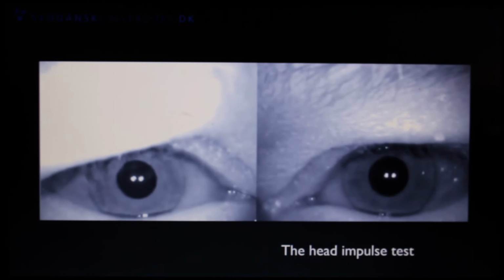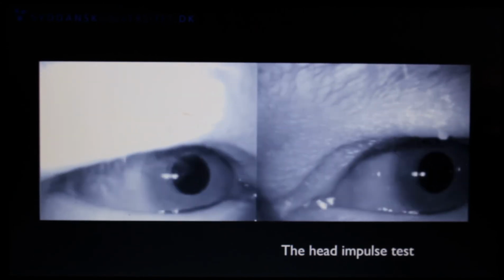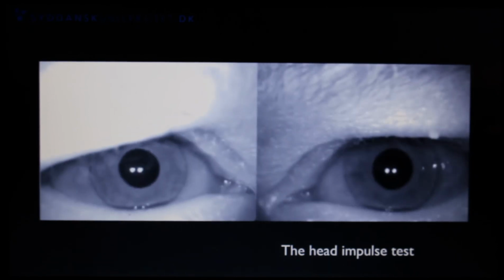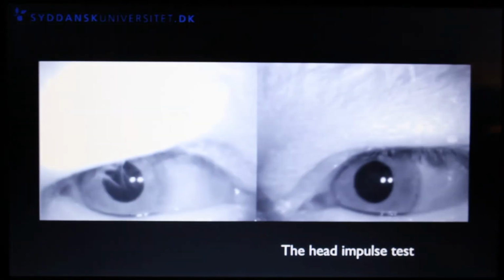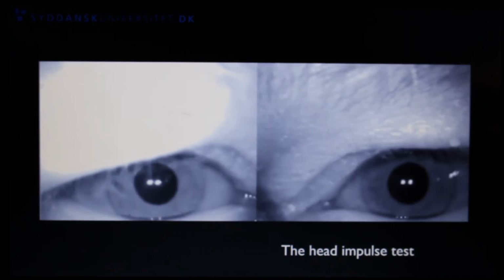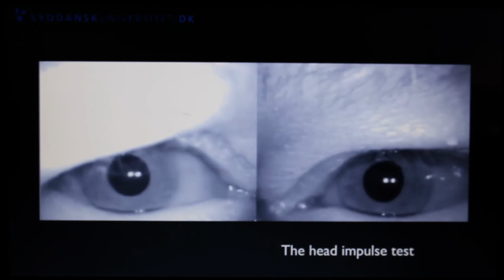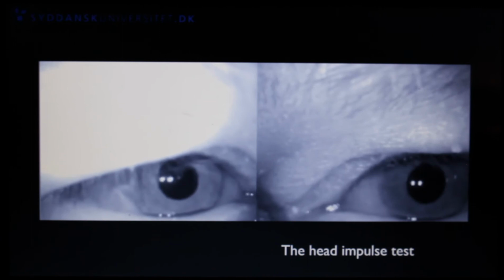This video clip shows the head impulse test towards the left, and it's negative, equivalent of a normal vestibular ocular reflex. This video clip shows the head impulse test to the right, and it's positive, equivalent of pathology in the right inner ear or along or in the right vestibular nerve.